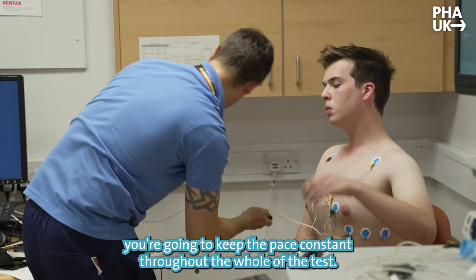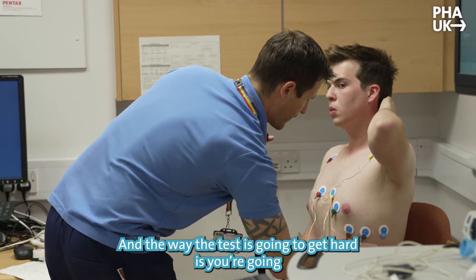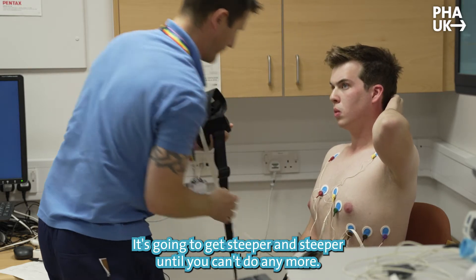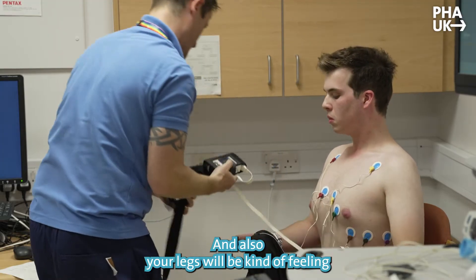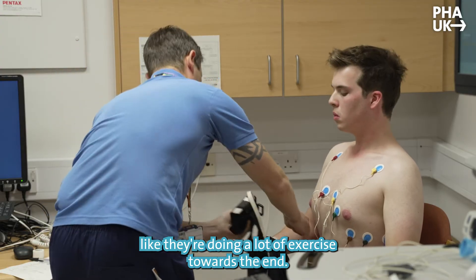For you, you're going to keep the pace constant throughout the whole test. The way the test gets harder is you're essentially going to cycle up a hill that gets steeper and steeper until you can't do any more. At the end of the test we expect you to be breathless and your legs will be feeling like you've done a lot of exercise.